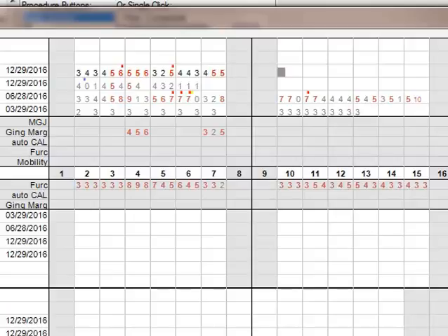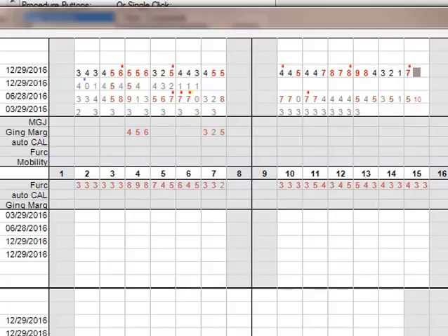Tooth 10: 4, bleeding, 7, bleeding, 8, 10, 4, 5. Tooth 14.